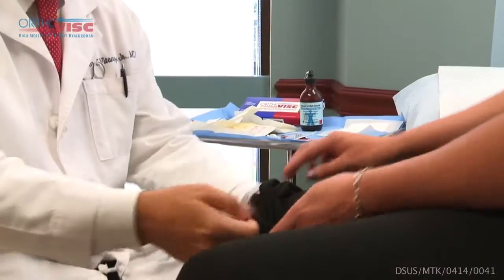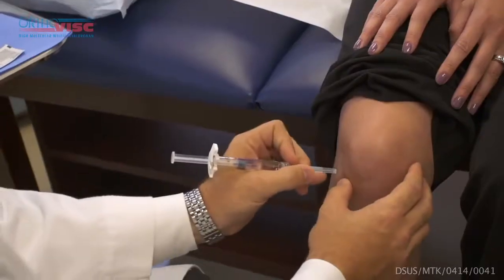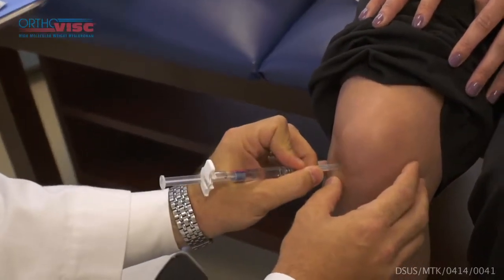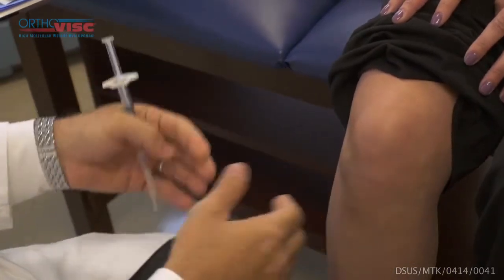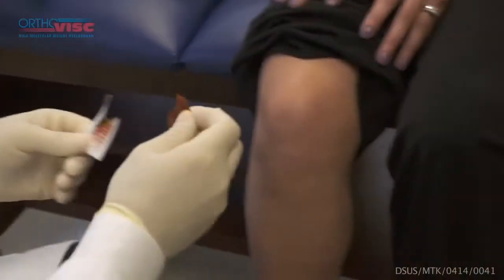What I will do is pull your pant leg up, examine the knee, and then make my mark as to where I'm going to inject the needle. One of the reasons I do this is that once I prep the skin sterilely, I will know where I need to go in and I don't have to touch the skin anymore, which will minimize any potential chance of infection for your joint.